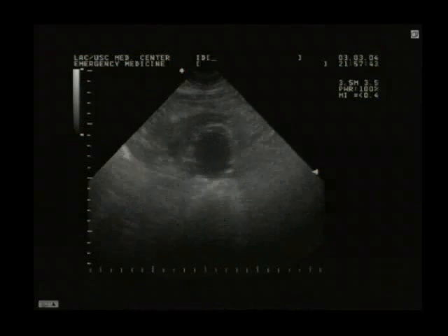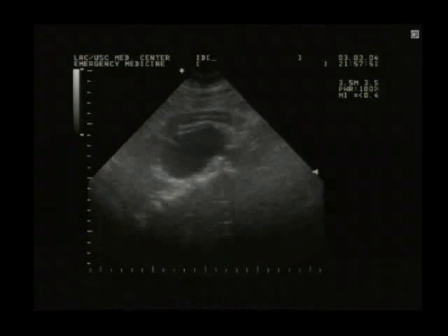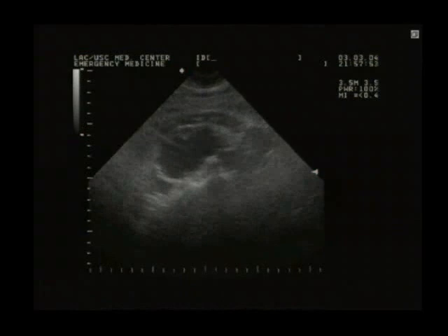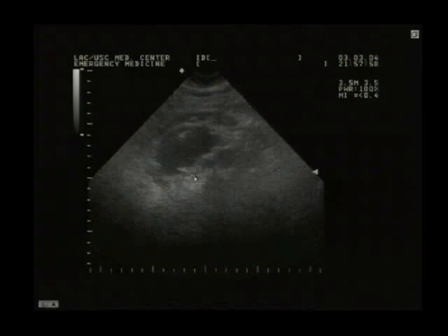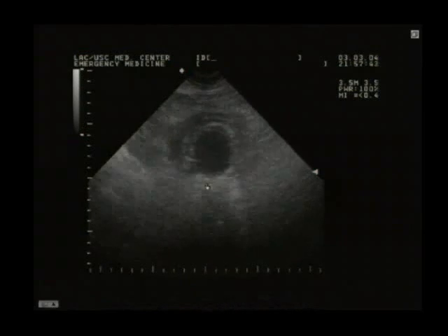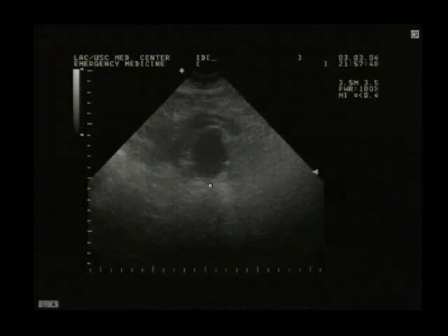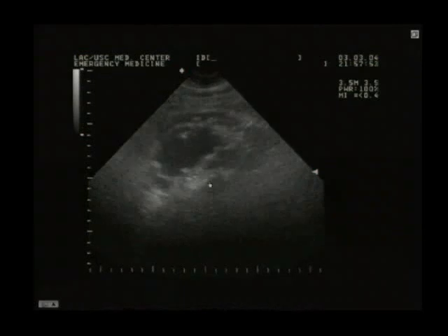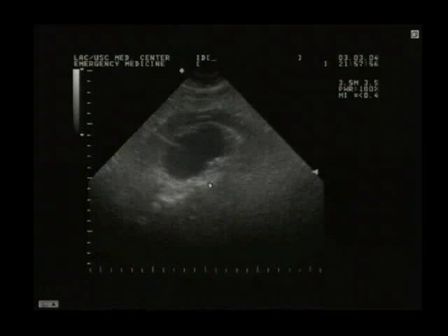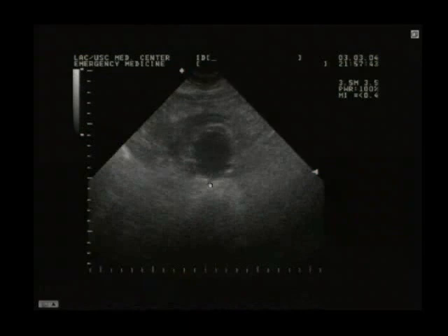Take a look at this. There's another large aneurysm. Scanning mid-abdomen. Now this is more longitudinal. This is the outer aorta right here, all the way to there. Right from there to there. There to about there. So this is about a 6 centimeter or more aneurysm. Right now, that's longitudinal. Now, we're transverse.